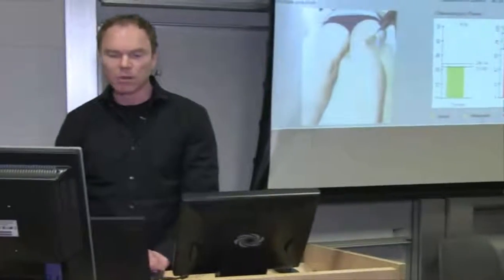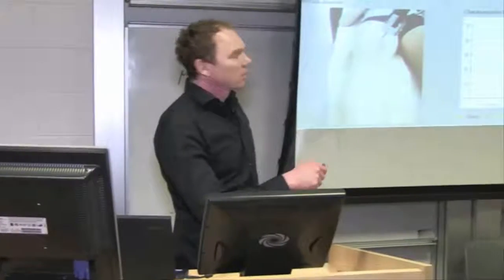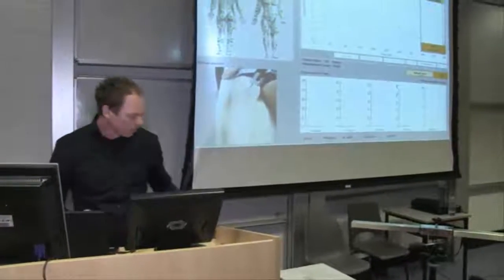So we'll just do one lateral symmetry, and then we'll turn him around and do the functional symmetry, so you will see. So when I change to the other leg, now this green curve is the same muscle on the other side. So we'll have immediate comparison between left and right.